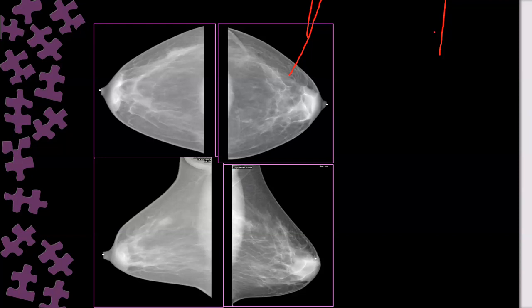It is the pectoralis; both sides look the same. Yes, it looks like the pectoralis we have seen in the CC. It's like the pectoralis seen in the extended lateral view, as if they have done an extended lateral. Semilunar, rather semilunar.